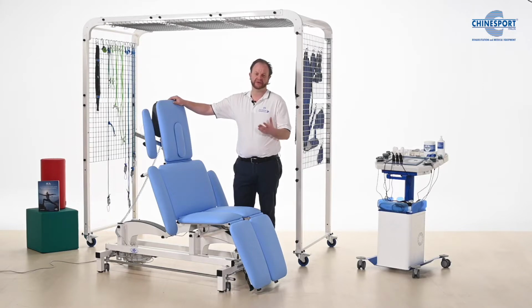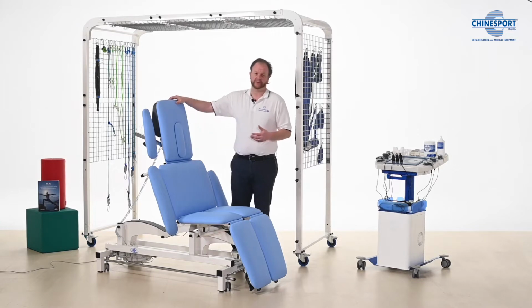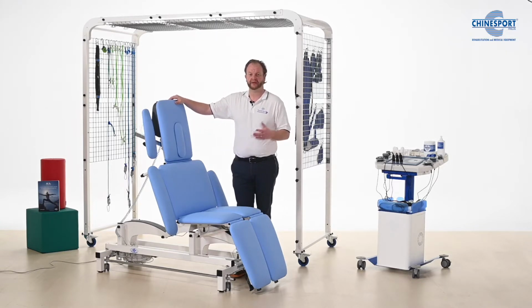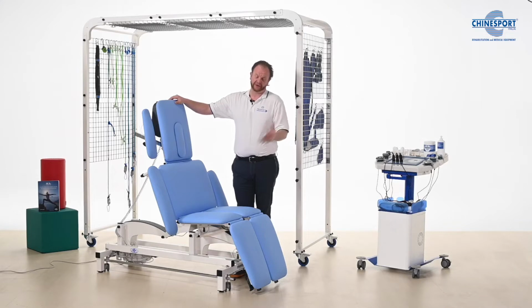And let's just imagine, as I'm a physio, that we have a patient with very acute back pain, and you all know that it's very difficult for people to actually lie down on the table on their belly or on their back. So we're just going to demonstrate how we start a treatment and take you through the different phases. We have a patient here.